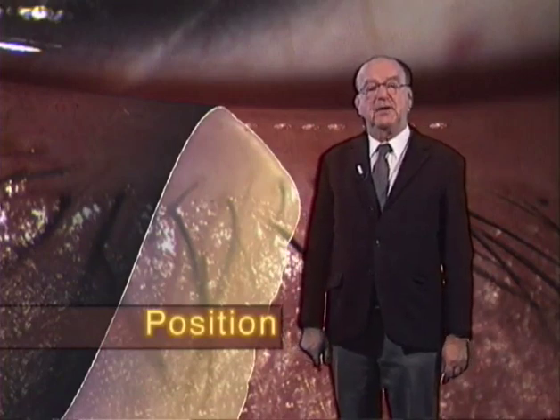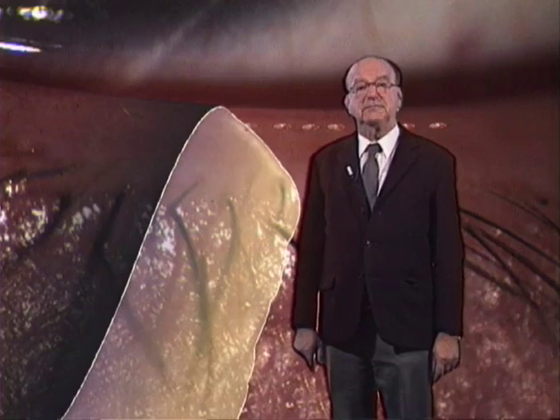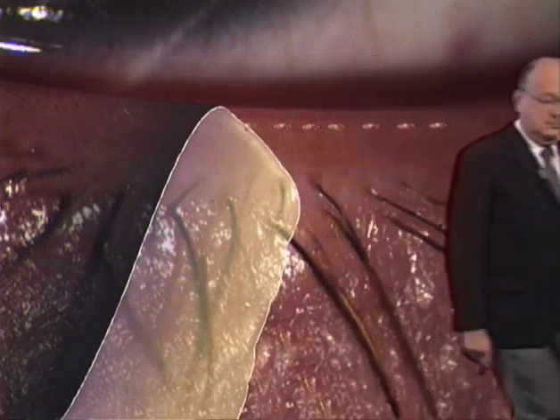Any change in its position or its shape impairs the windscreen wiper function of the lids. The transsectional contour is best evaluated in the narrow slit beam because the optical section gives precise information as to the position as well as to the shape of the lid edge.